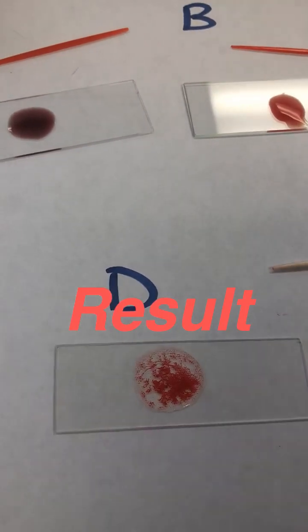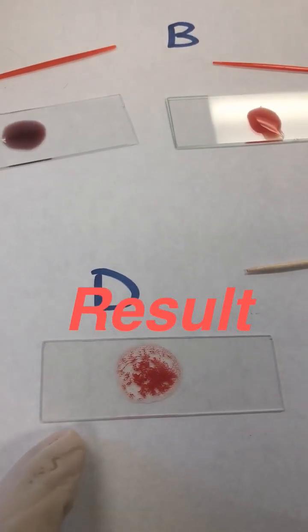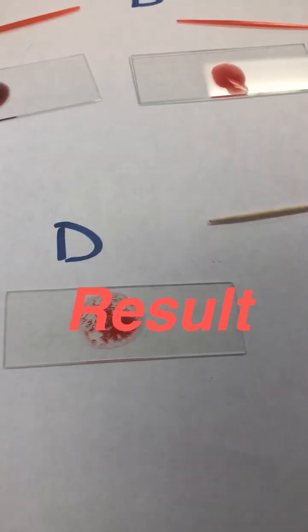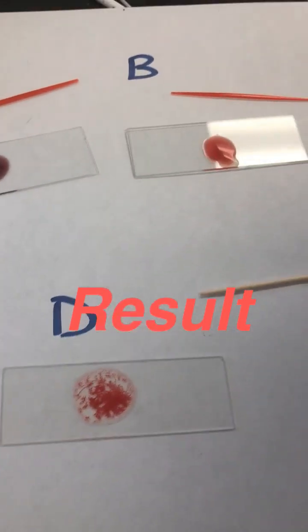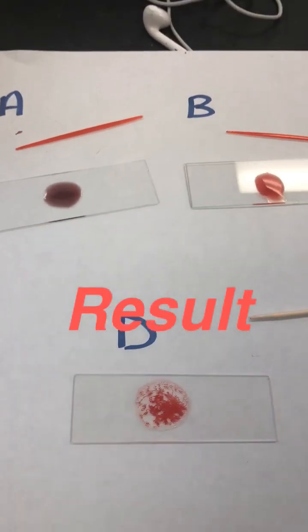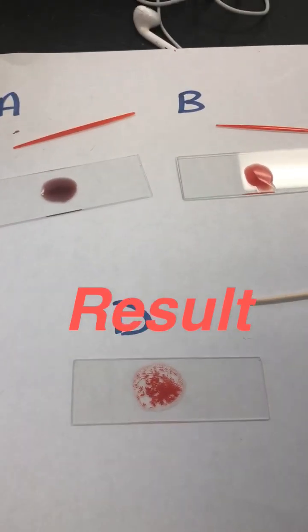What's your blood type? O. And your RH — is it positive or negative? Positive. Check positive. So you are O positive. I'm O positive!